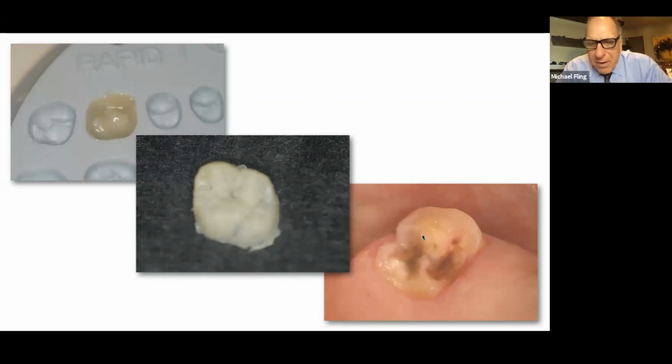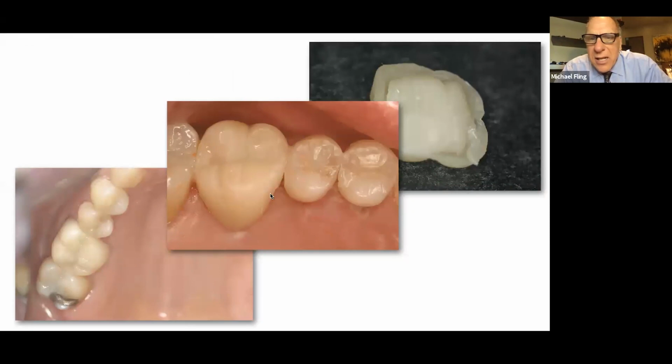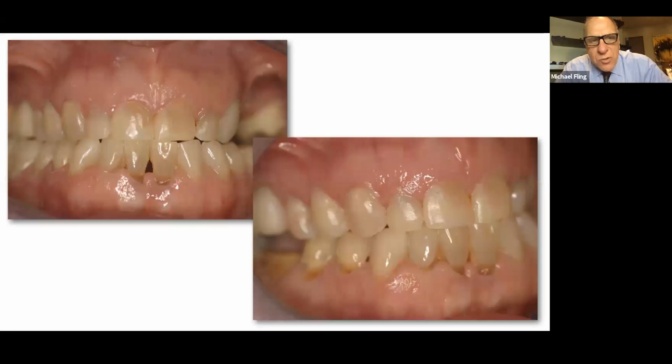I seat it in place. I bond it in place. Here is her core filling. So here you see it right here. That's what she's going to wear while she goes through ortho. And then after she's gone through ortho, I then can go back and transition that to a permanent crown.